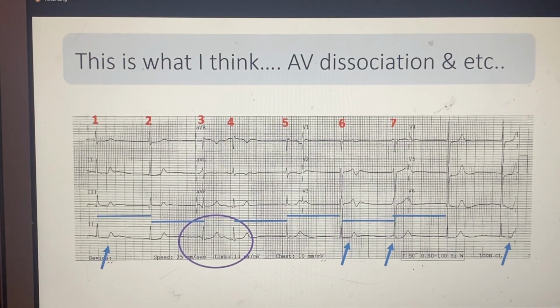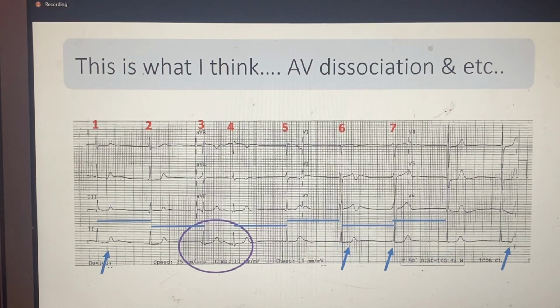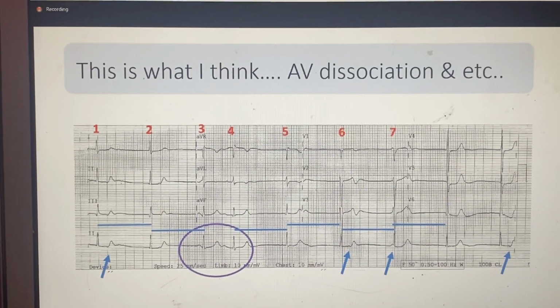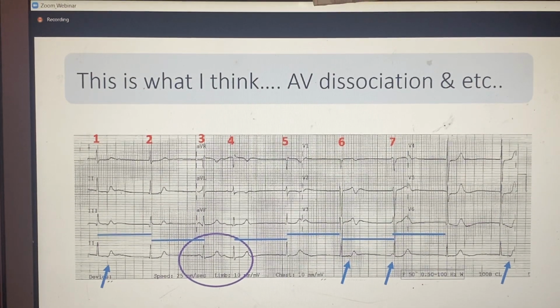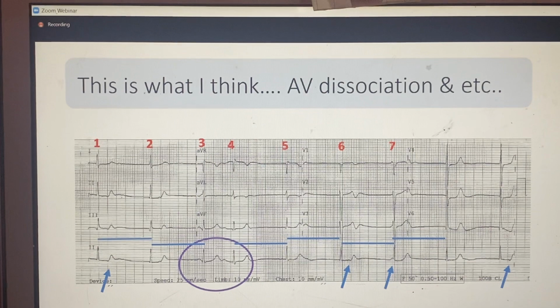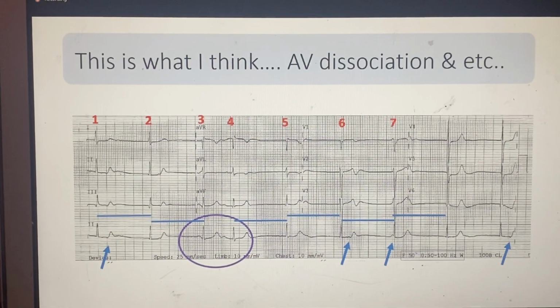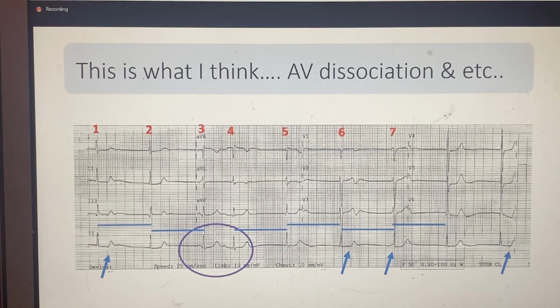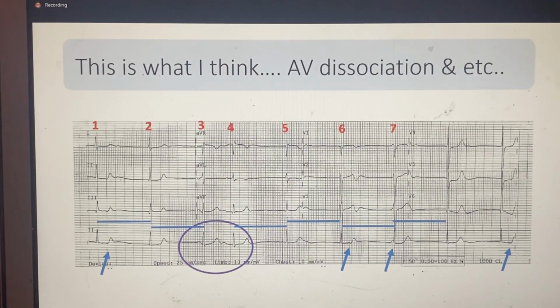If you stress test the patient, sometimes the sinus node also is not good. It cannot fire, the chronotropy is not competent. But this is a good example, where you try to pinpoint where the lesion actually is, whether it is a sinus node issue or an AV node issue.